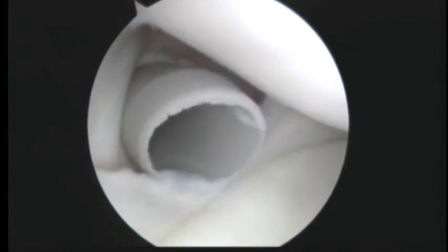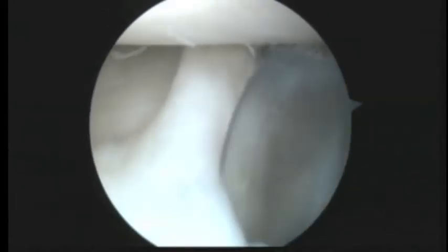What I'm trying to decide now, Dylan, is if we have to do anything else. Back here, this looks good. Don't see any significant problems here. Hold this, and then as we look down the front, that looks pretty good. I'll tell you what we're going to do. We're going to put in the shaver, and then we're going to put the camera in the back one more time. Possibly.